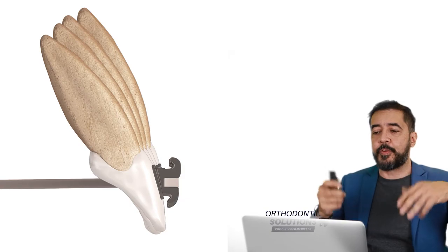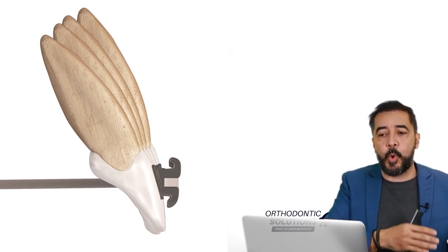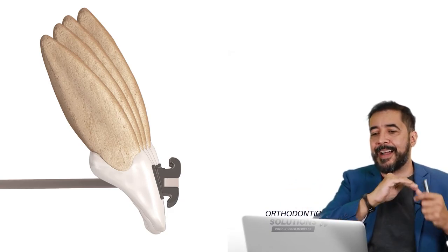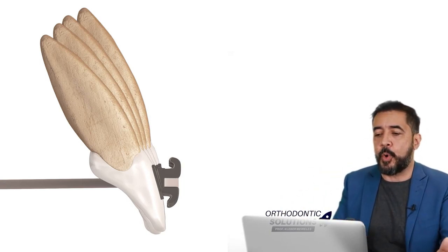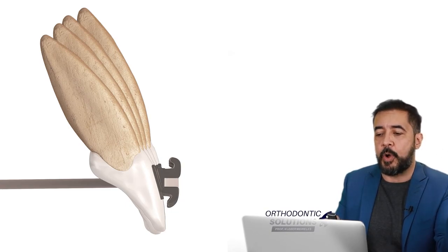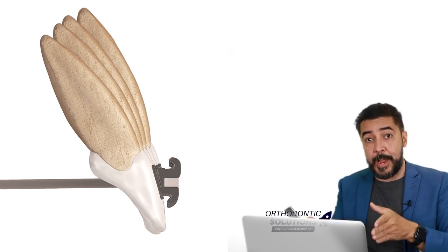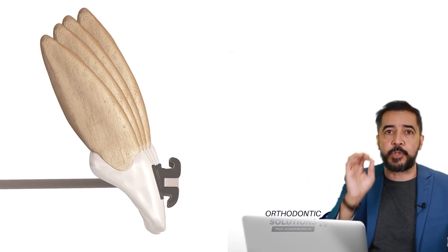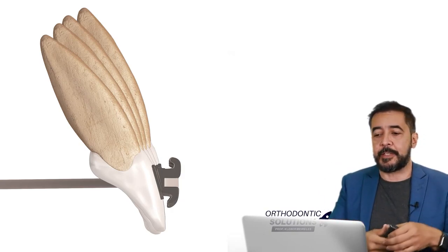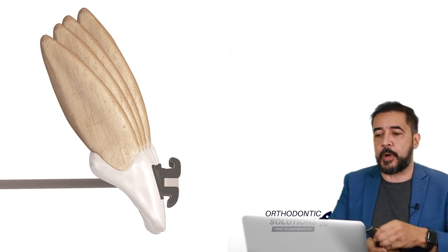So when you do this kind of reading of the inclination, we are trying to do a smoother, more linear treatment without the need of doing many torques or many bends to correct individually the position of those teeth, okay? We know that's not what we are going to do in our day-to-day practice, but this is how the thinking goes. This is what was planned when the prescription is sold, when we buy the prescription to put in our patient, okay?